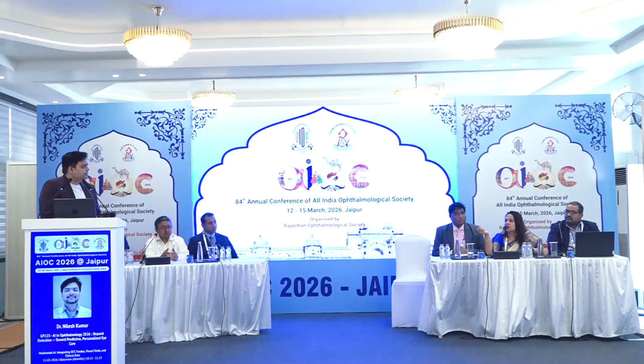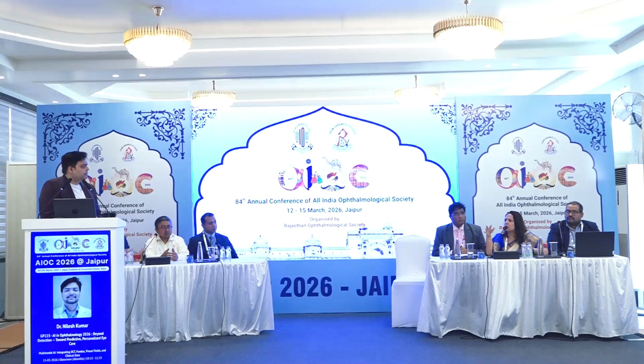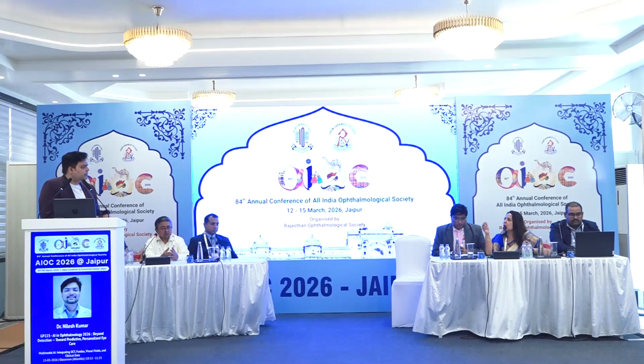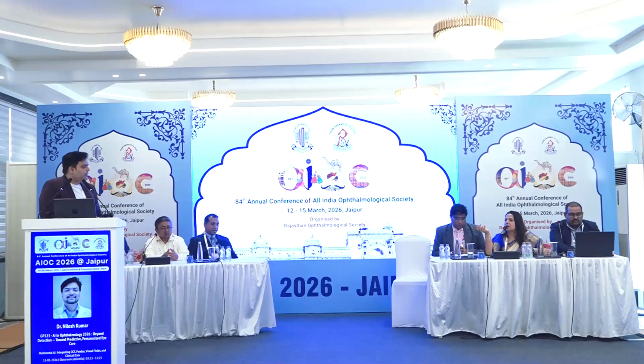For this, a couple of practical things might be challenging. If I don't want everything in one instrument, it might become too tech heavy for me. So it is all based on how big your infrastructure is and how much tech you need in it. For institutions it is okay, but if I want to use it for teleophthalmology or peripheral screening, having OCT and everything as one input might become too heavy.